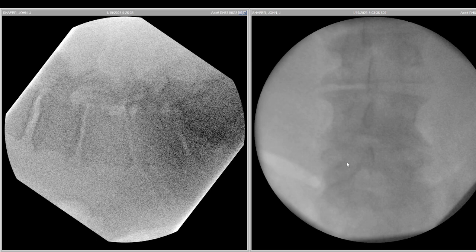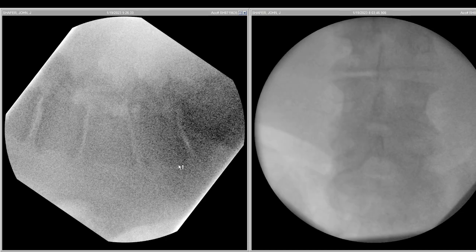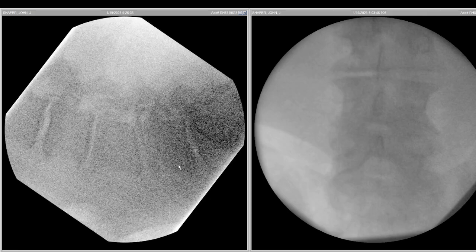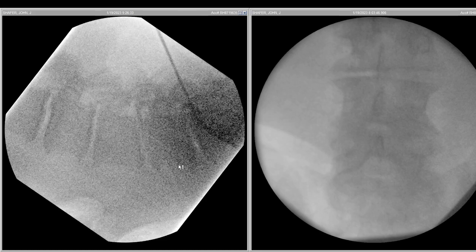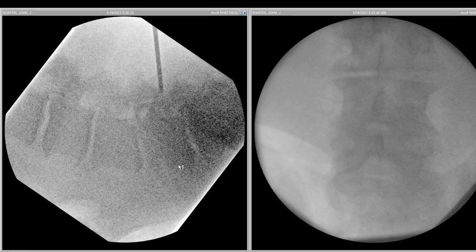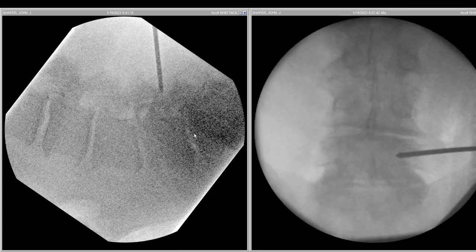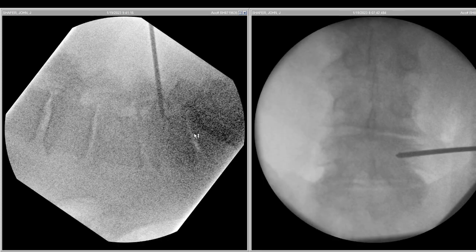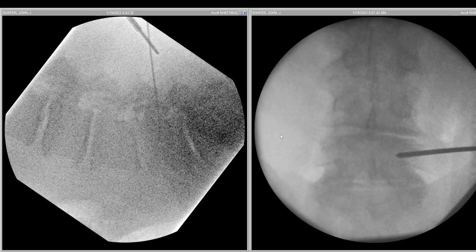With positioning and taping, we are able to improve some of these pictures. Once we are able to see enough of the anatomy, we mark the trajectories in both the AP and lateral. One of the first steps is that we put a Jamshidi in.